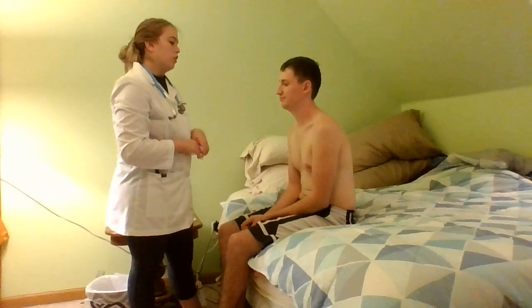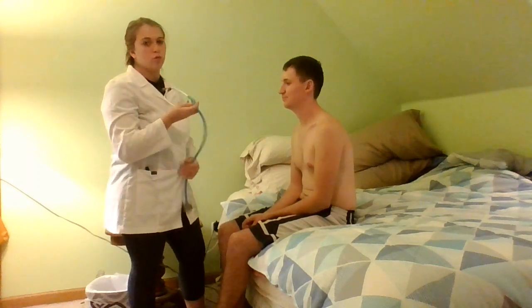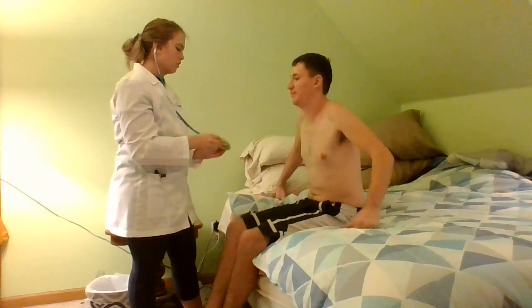I am now going to auscultate using the bell of my stethoscope, listening for any wheezes, rhonchi, or anything like that. So every time I move my stethoscope, just take a nice big deep breath. Alright.